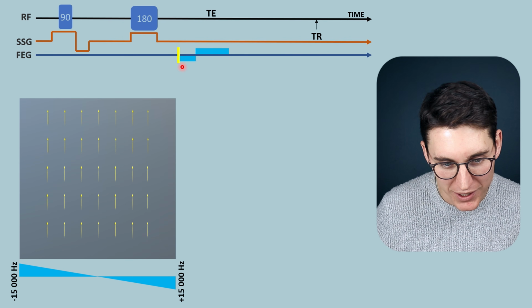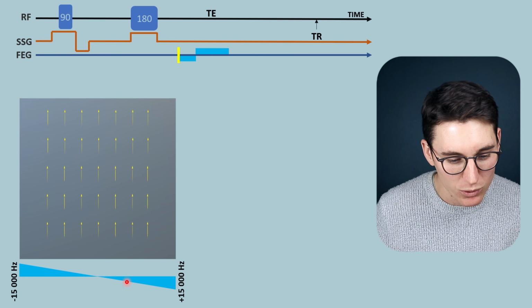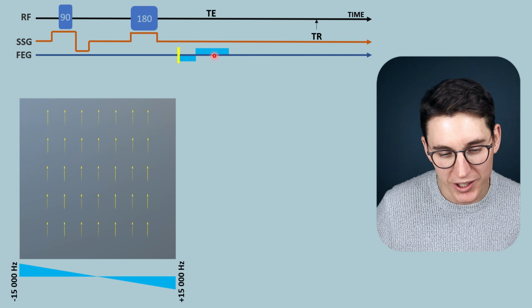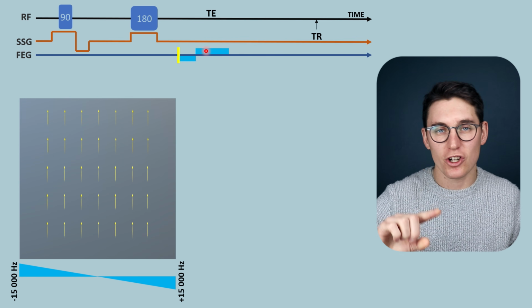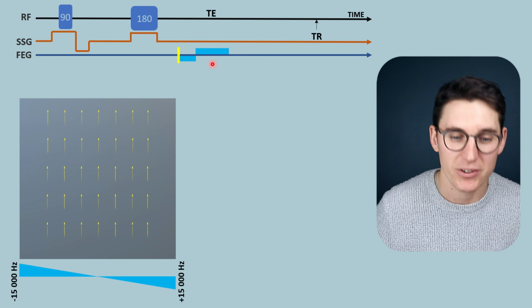We first start by dephasing with a frequency encoding gradient by applying an equal and opposite frequency encoding gradient here. That allows us, when we measure the signal out during our rephasing frequency encoding gradient, to have signal that is building up as those spins start to precess more and more in phase because we've allowed them to dephase first.